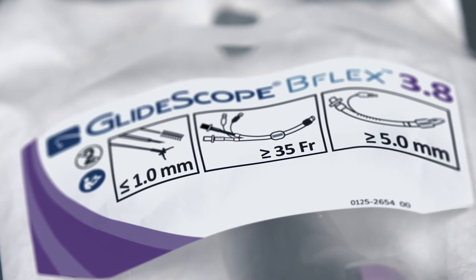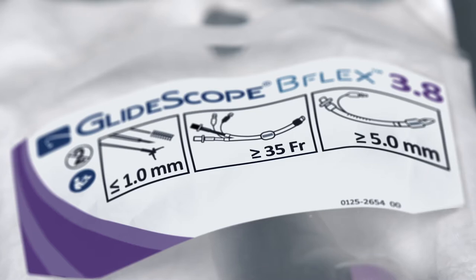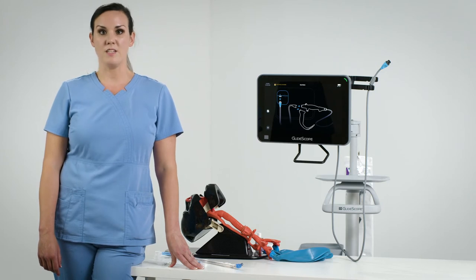We can use the B-Flex 3.8 millimeter single-use scope for intubating double lumen tube size 35 French and larger. It's also helpful for confirming tube placement after intubation. This technique may be used in the operating room for thoracic surgery procedures or in the intensive care unit if a patient needs lung isolation.